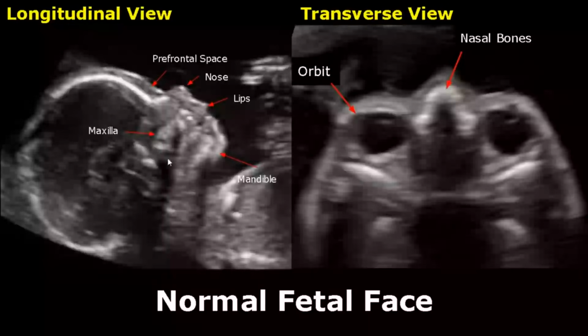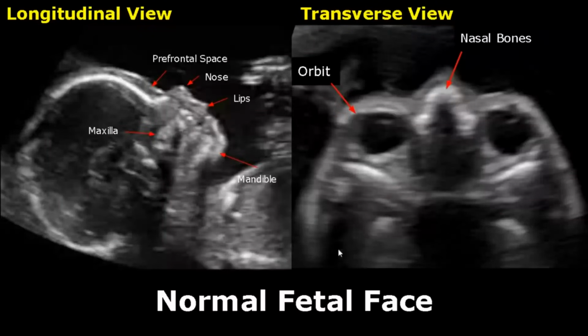Today we will study fetal face ultrasound. Scanning the fetal face requires high quality equipment and experience. These are longitudinal and transverse views of fetal face. The sagittal facial profile is best for evaluating the face. We can see a lot of structures.